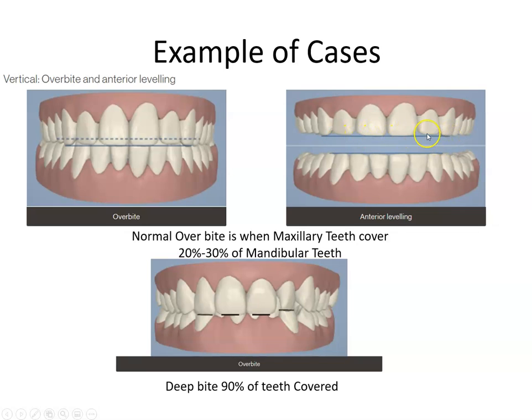Now when we're seeing anterior leveling, when we open wide, in this case you could see that all the teeth are aligned and the side teeth are slightly up. And we would want to bring these up a little bit more. As you can see, the gums are really low on the side teeth, so that means we have room to bring them up. On the bottom, remember what we learned in that photograph with all the numbers, we want the sharp teeth to be higher than the lower teeth. So anterior leveling, we're gonna bring these four down a little bit.